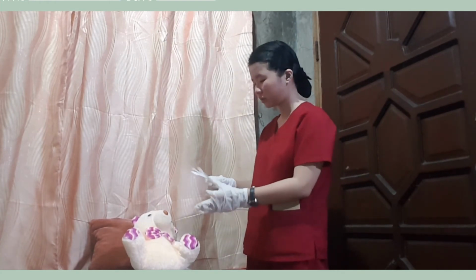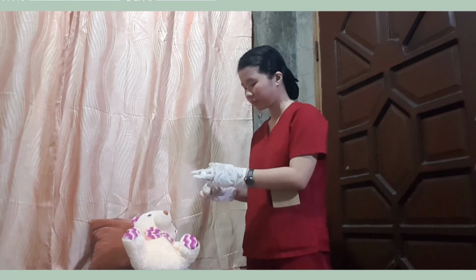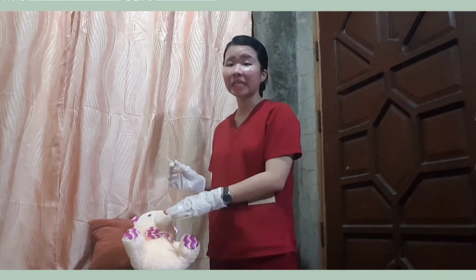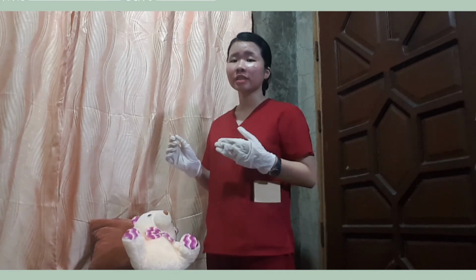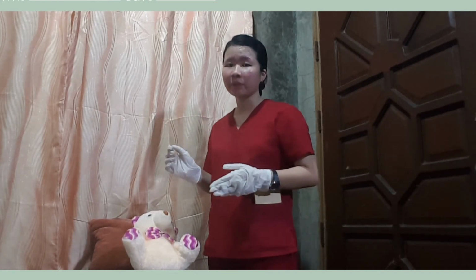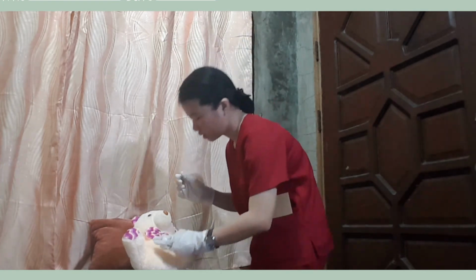And after doing this, you need to proceed to the next procedure, which is to remove the cap with the dominant hand, and this is to prepare the syringe before administering, and inject slowly and evenly the medications at an angle of 45 to 90 degrees. This is to reach the subcutaneous tissue and lessen the pain to the patient. And while we inject, count 1 to 10 after fully injecting the medication. Then you can remove the needle. This is to allow medication to diffuse to the surrounding tissue.